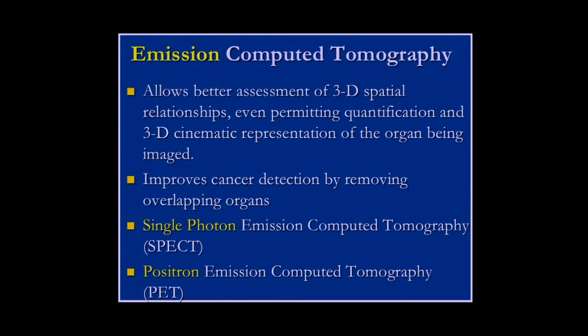Now, that's a 2D image. And I talked about the advantages of doing 3D imaging, so I'm going to have to do a little bit of discussion of the instrument without getting everybody too lost. So when you do computed tomography or slices, you get better detail. Stuff doesn't overlap with other stuff. Now, computed tomography, you heard about already with x-rays going through you.